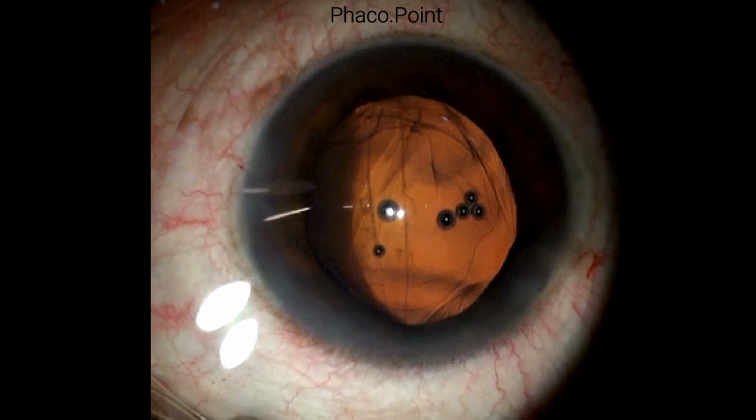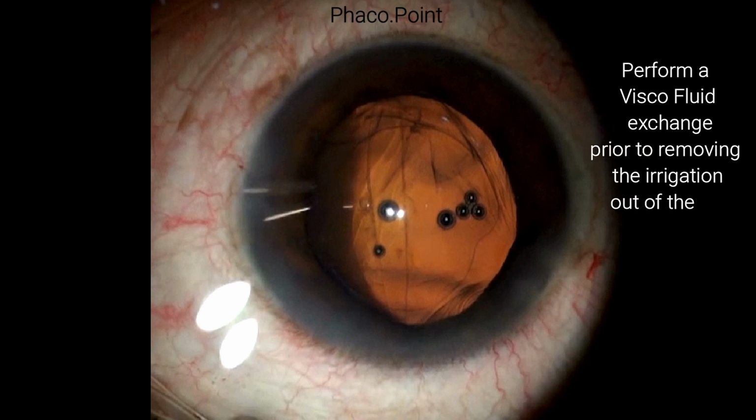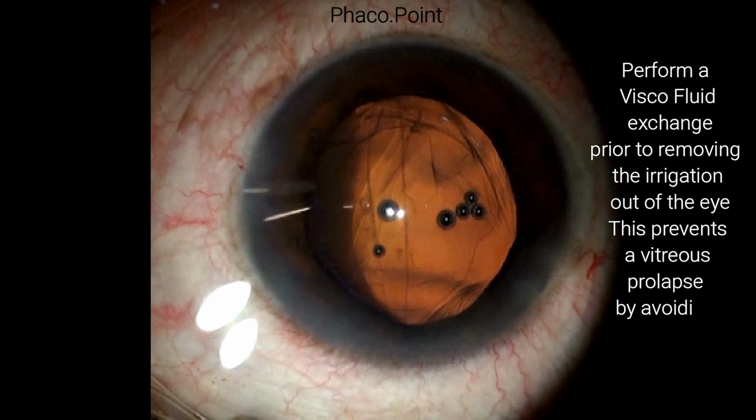You go ahead and proceed with your cortical wash. However, it's very important to remember one important step. That is, when you need to change the sides of the irrigation aspiration to complete the second half of the cortical wash, it is very important to ensure, without fail, that you remember to perform a viscofluid exchange prior to changing the hands during the irrigation aspiration in such a case. Performing this step of viscofluid exchange will prevent the herniation of vitreous through this opening in the posterior capsule.